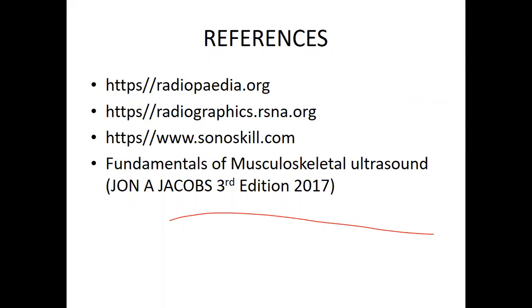However, when you have experience in what you are doing, and you know exactly what you are looking for, in my opinion, I think that can still be done, provided you know exactly what you are looking for. But with superimposition, and if you want to demonstrate certain specific structures, you may not bring them out. Like, how do you see the bursa when the patient is supine? Unless it's obviously inflamed.